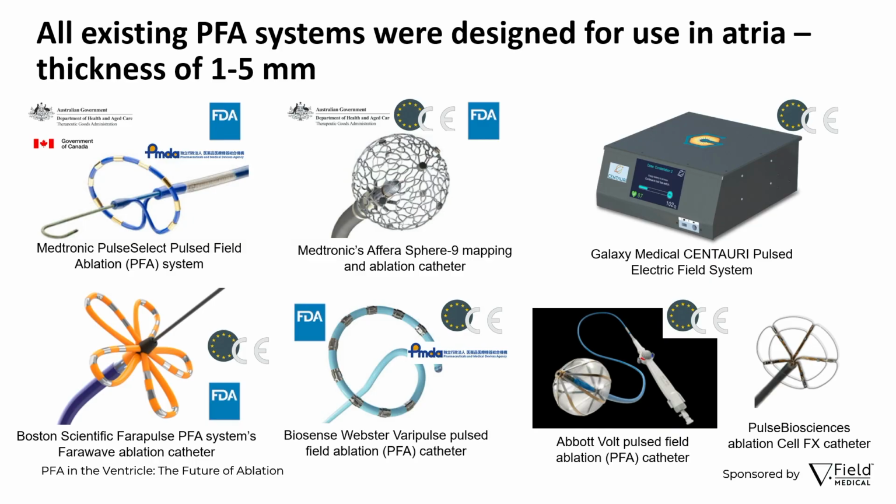So all the existing PFA technologies and systems were basically developed for the pulmonary vein isolation. That's, I believe the expression is the low-hanging fruit, but also a very big market.